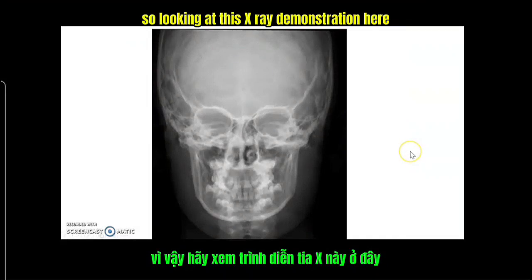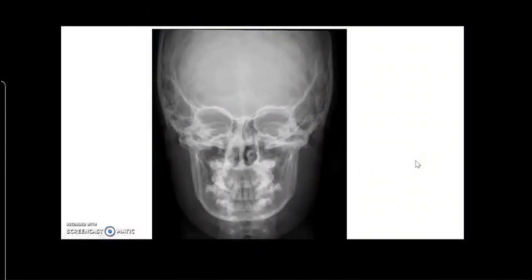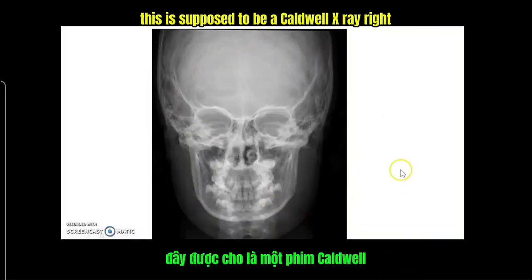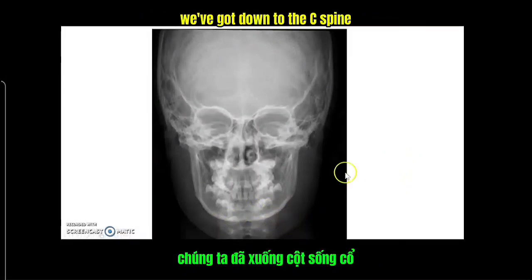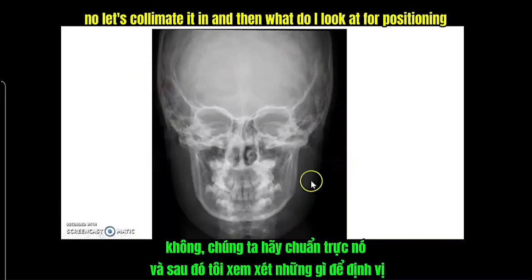So looking at this x-ray demonstration here, I want you to evaluate it for quality. So look at it for me quickly all the way around. This is supposed to be a Caldwell x-ray, right? So number one that's jumping out at me is collimation. We've got down to the C-spine. We've got the whole skull. Do we need that? No. Let's collimate it in.